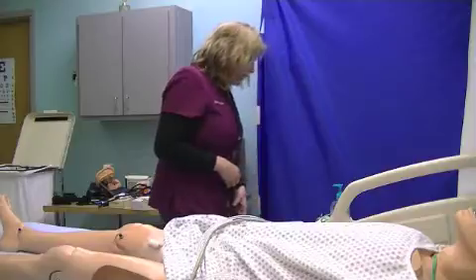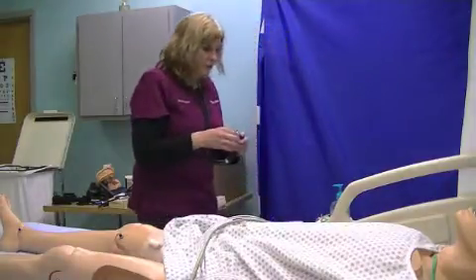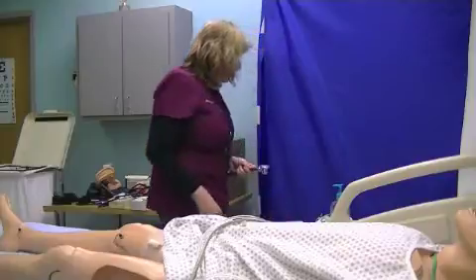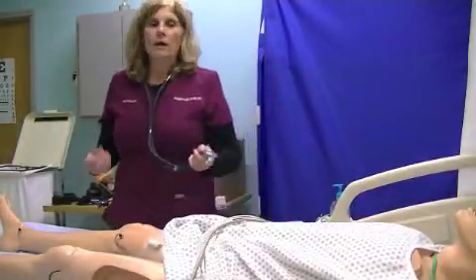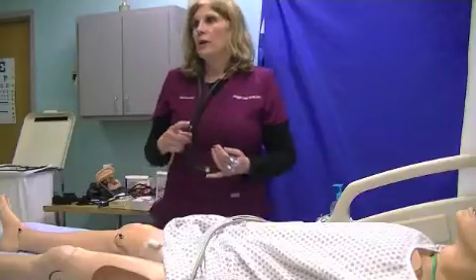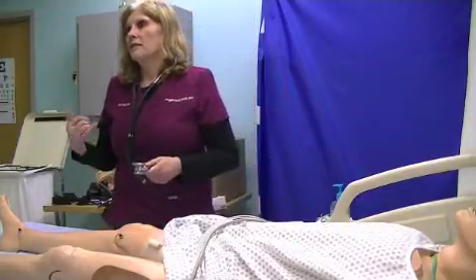The other thing, when you're done, is to take an alcohol wipe and clean off your stethoscope so you won't transmit anything to your patient again. So I'm going to note the heart rate. Like I said for the radial pulse, I'm going to note the heart rate for the apical pulse and make sure the rhythm is regular. I'm going to make sure it's between 60 and 100 beats per minute, and the quality is 2+.